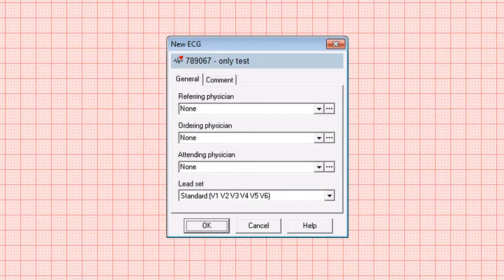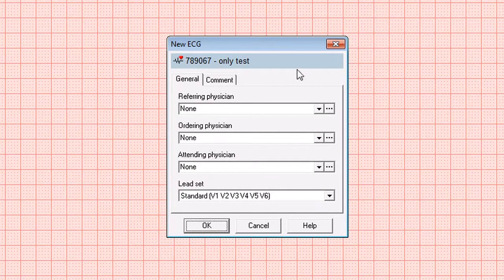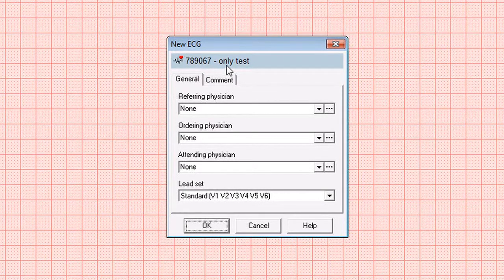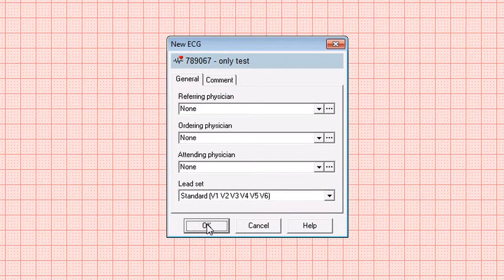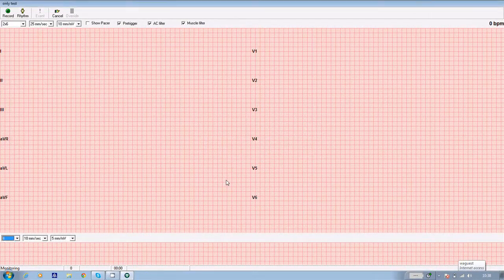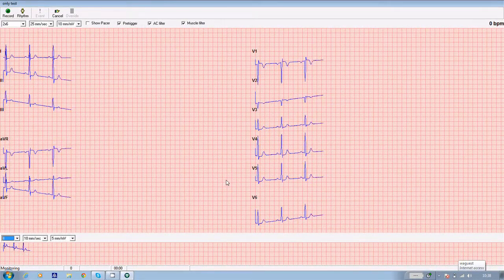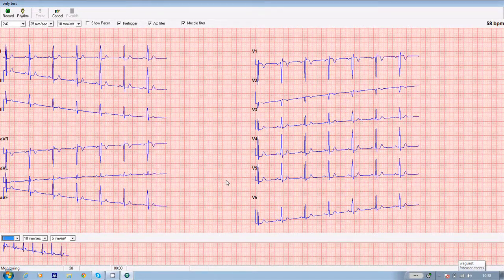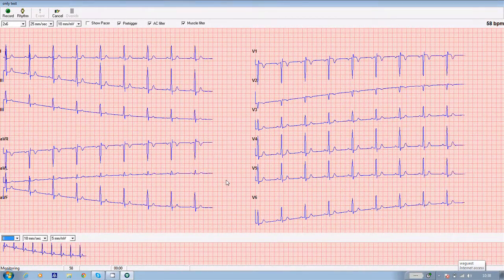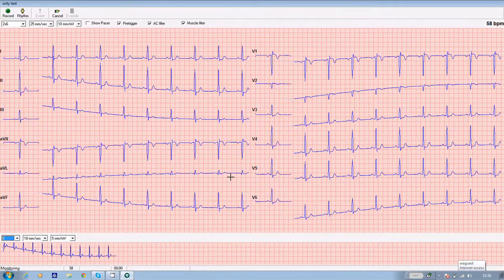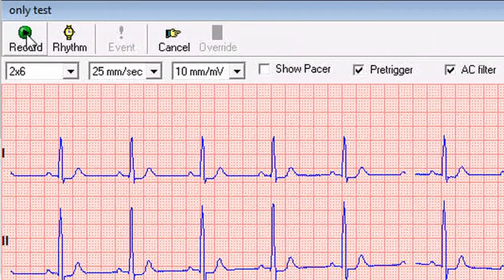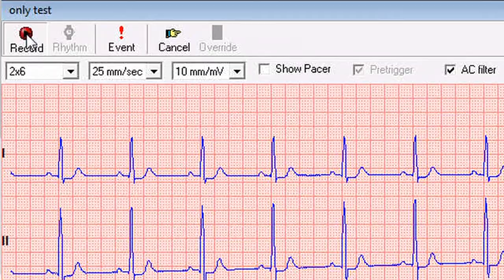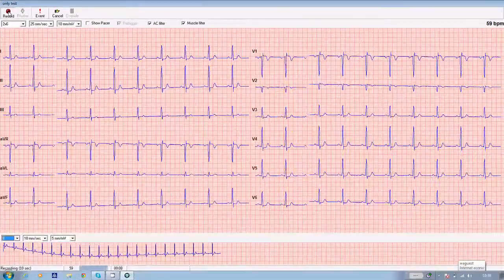The software then loads the module. You get a box up on screen which says new ECG, confirms the number and the name of the patient, and all you need to do to take the ECG is to click OK. The traces will then appear on screen in real time. Now you can wait until these have settled down and stabilized and you're getting a good trace from each of the patient's leads. And when you're happy with that, you click on record in the top left hand corner of the screen. And from that point, the software records 10 seconds of ECG.